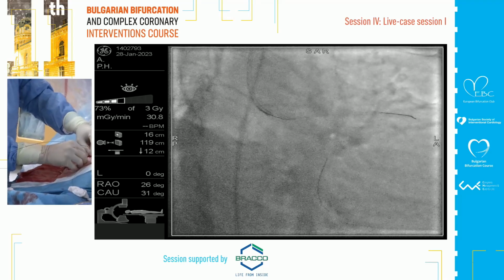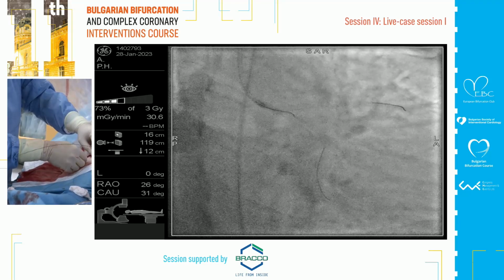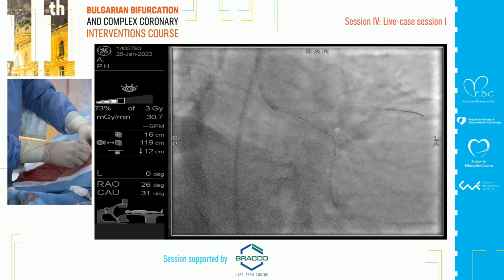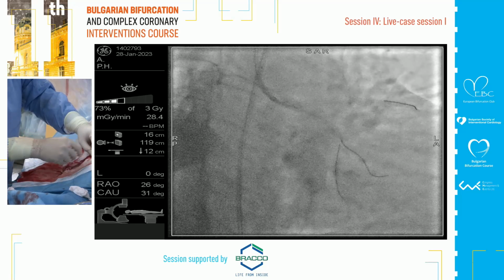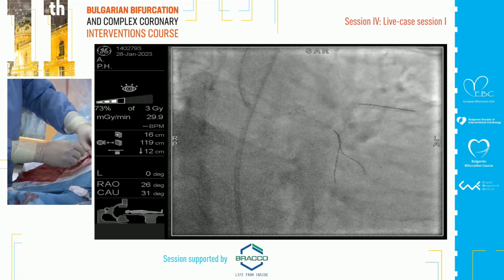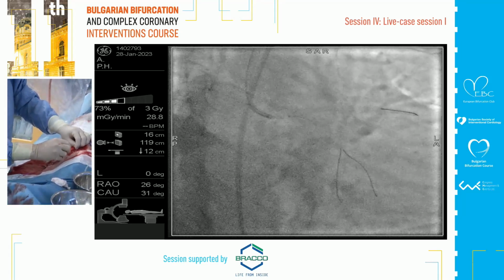But we haven't discussed your choice in terms of stents. What stent did you use? This stent is Science. It is 3.0, and this is what we found by IVUS, because 3.0 is the diameter media to media. Media to media is 3.1. 3.1, yeah. 3.8.